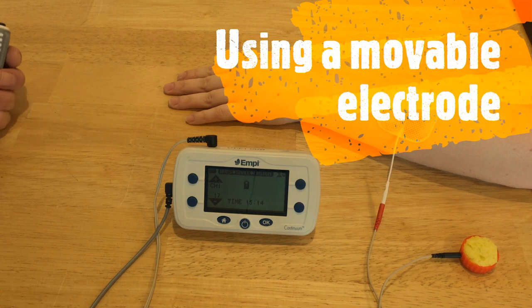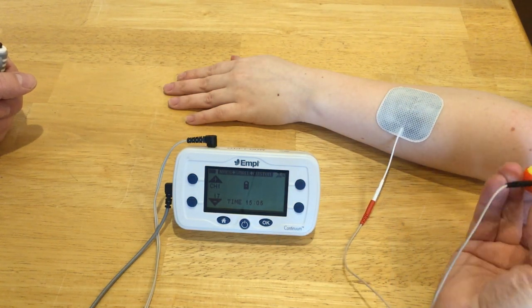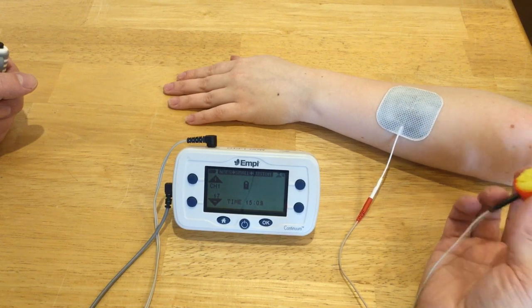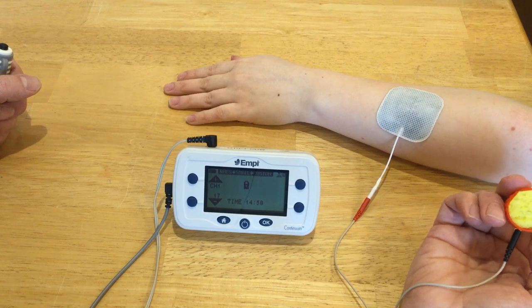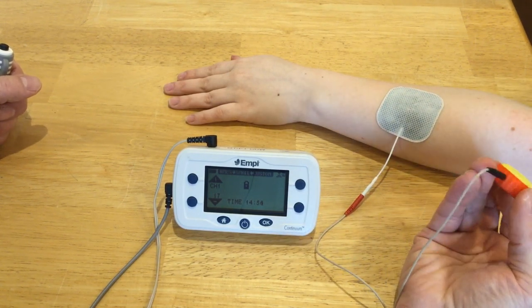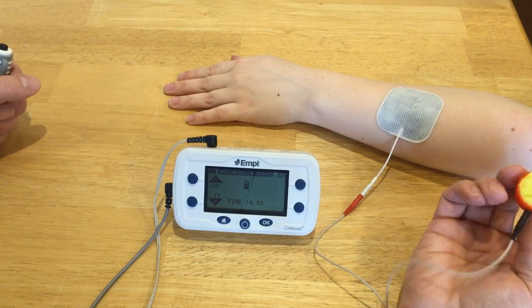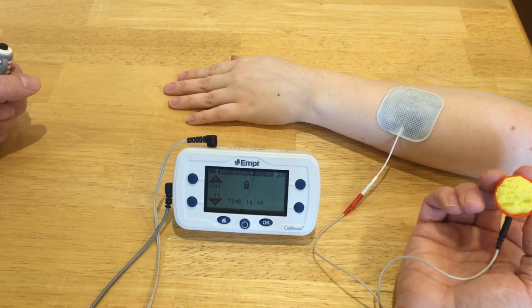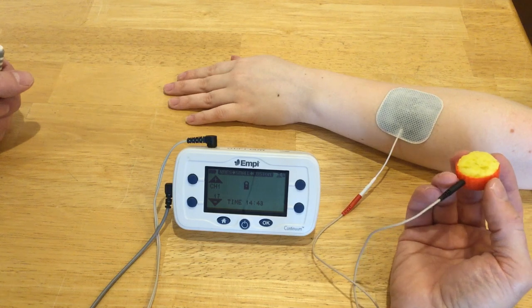If you're having difficulty finding a good place for your active electrode or primary cathode, one thing you can do is use a movable electrode. You can make one yourself — this is just a two-liter bottle cap. Inside I have a piece of regular kitchen sponge. I've punched a hole in the side of the bottle cap so I can insert my lead wire in through the side into the sponge, and I've wet the sponge with saline solution.